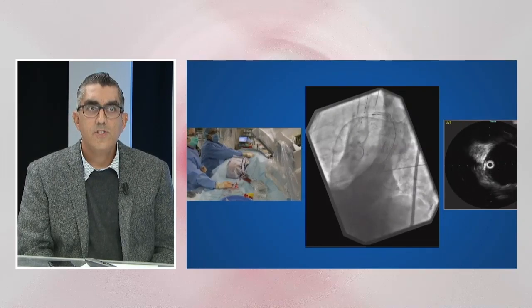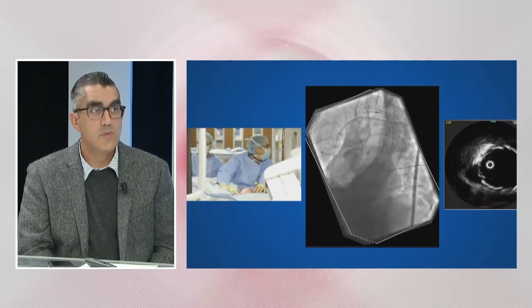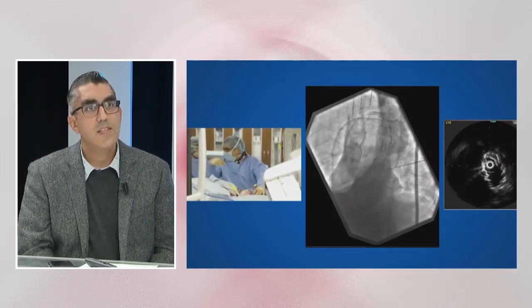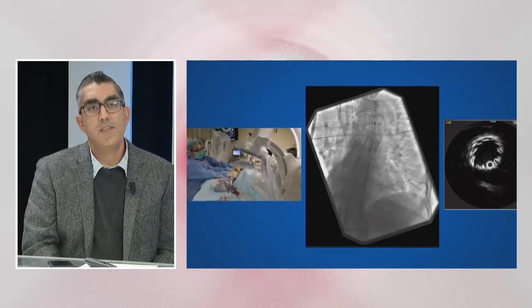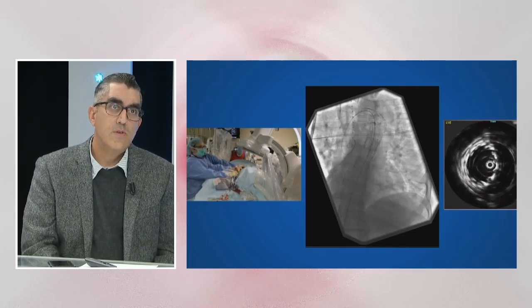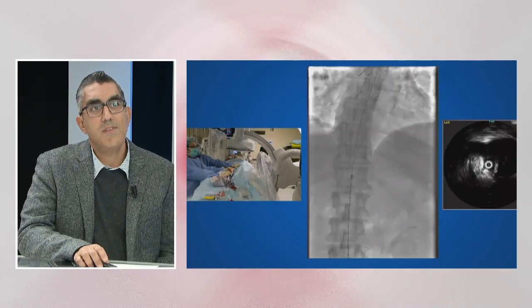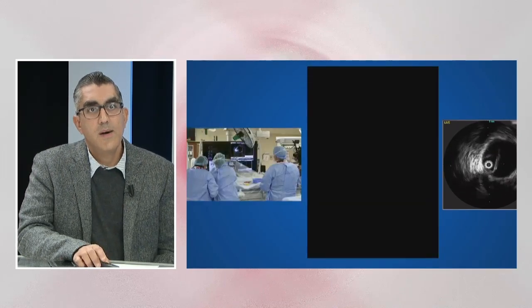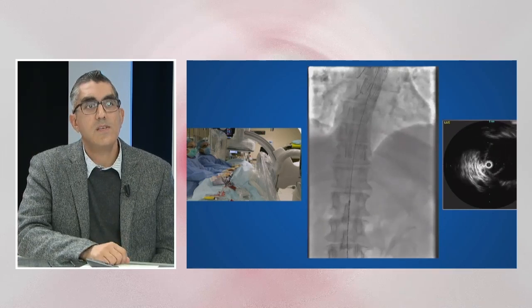I have on occasion seen the aorta remodel, especially if you have a subacute aorta as in this case, so I haven't always felt I needed a bare metal stent extension. The intravascular ultrasound showed there was almost a coarctation in the aorta as it took the turn. While it's not ideal to balloon dissections, I felt that leaving that portion of the aorta as-is would not be beneficial to the patient. We'll end up doing a little ballooning, and we're outlining where the celiac artery is so we can bring the final bare metal piece all the way down to the celiac vessel.